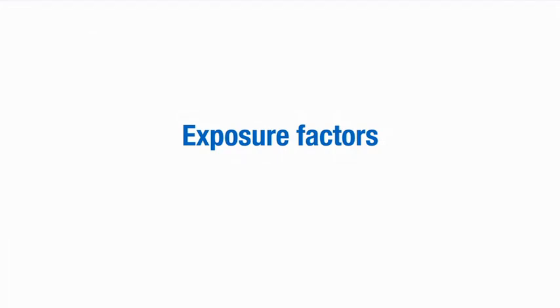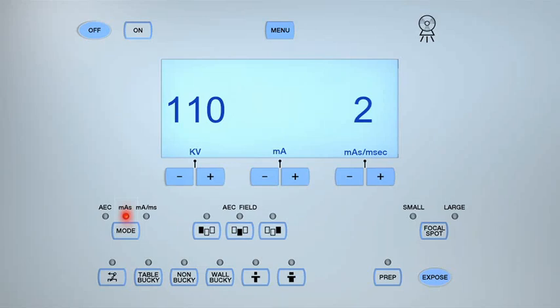The exposure factors determine the amount of radiation and the length of exposure time of both the patient and the image receptor to the X-ray beam. When selecting the exposure factors, it is important to consider whether a Bucky or non-Bucky system is used, and whether a large or small focal spot is required.